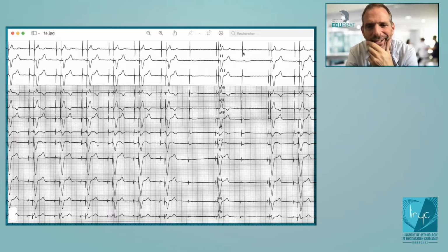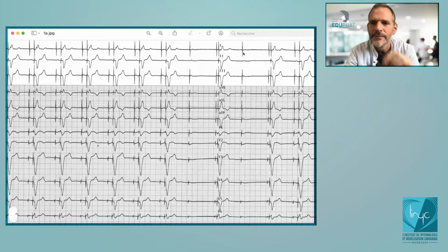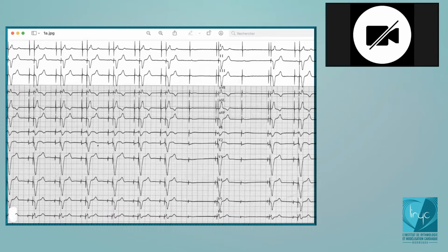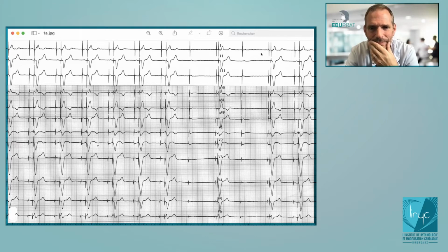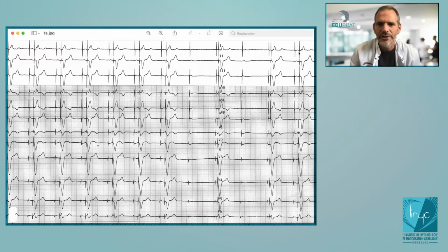Yes. Then it is still looking for a spontaneous AV conduction. Yep. Since only one blocked conduction is not sufficient to revert to DDD, it does not switch to DDD. So it does the same thing, where it just stimulates the atria and then launches a ventricular stimulation 80 milliseconds after. And since 2 of the last 4 beats are not conducted to the ventricle, it switches back to DDD. Okay, so that's clear for everybody.